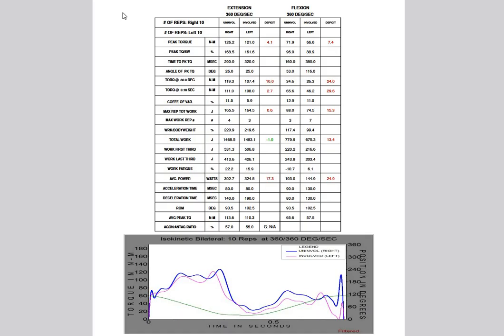Now, this is a report that is available to you on Brightspace, but I just want to point out that I'm not giving any unfair or undue advantage to this person's report and anyone who chooses to interpret this data, because I've chosen this page because there's not really that much to talk about.